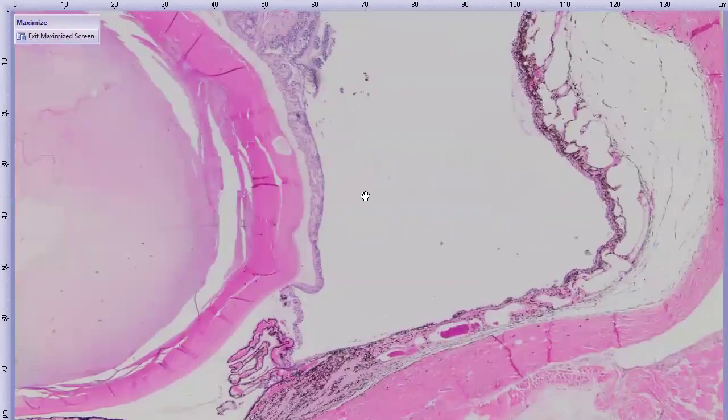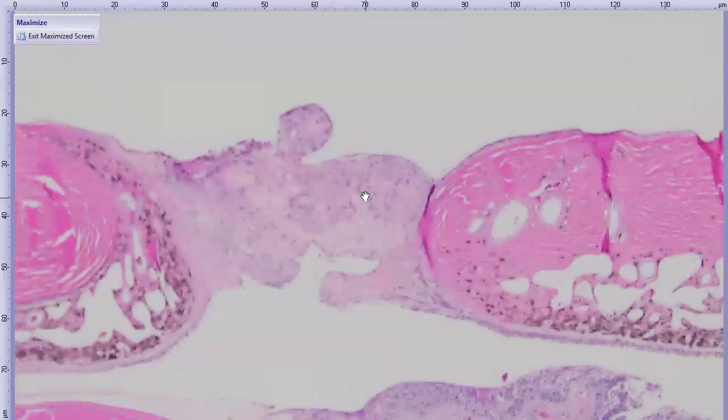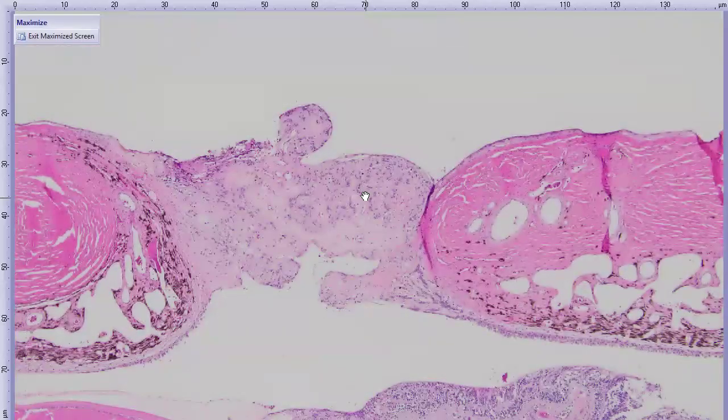Oh, it's backwards, sorry. Anyway, let's start with the cyst. So there's that hole in the sclera. It's filled with some weird tissue. You can see the tapetum here, which indicates that this is dorsal, kind of wraps around that edge of the sclera, and so does the choroid. And then the RPE kind of wraps around and disappears into this jumble of tissue.